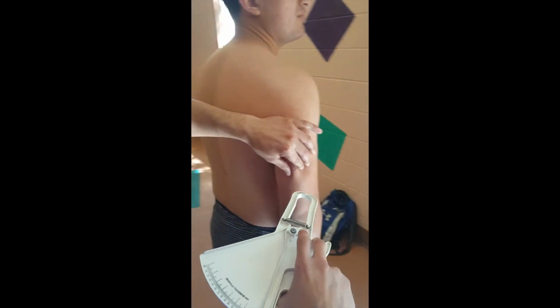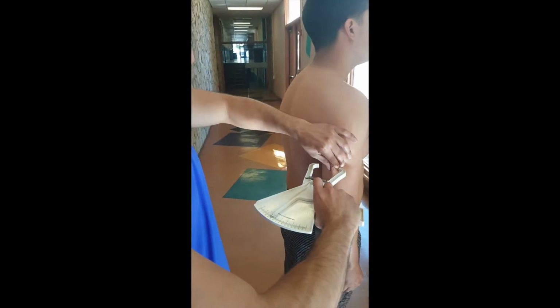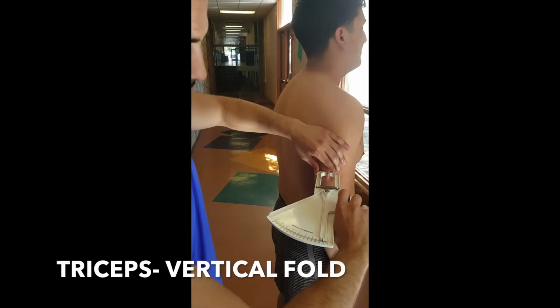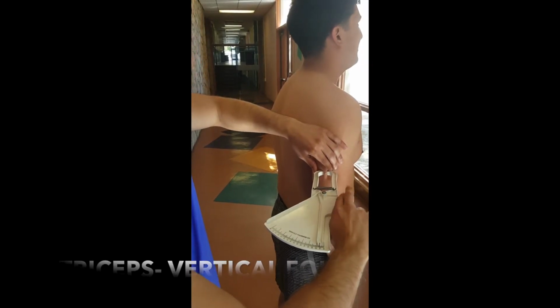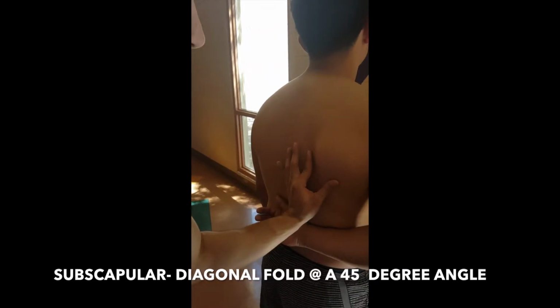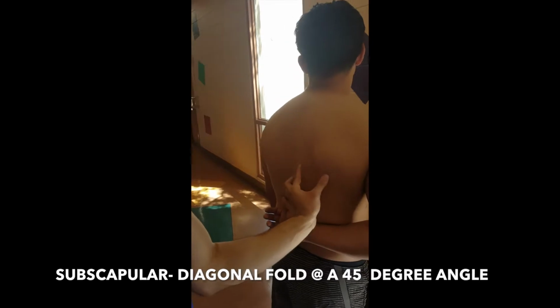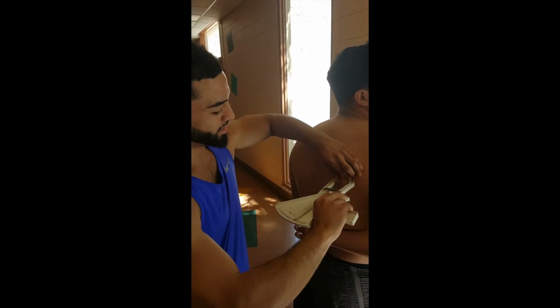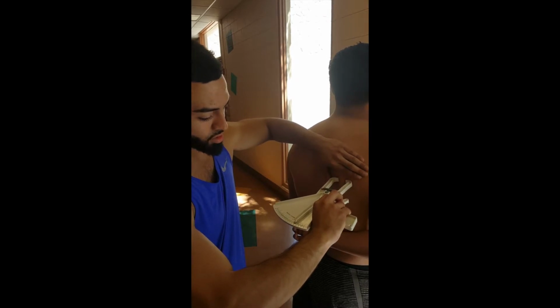With your left thumb and index finger, you will be grabbing the skin fold 3 inches apart on a line that is perpendicular to the long axis of the marked site. The caliper in your right hand with the dial facing up. Place the jaws perpendicular to the fold 1 centimeter below the fingers, halfway between the crest and the base of the fold. Record the skin fold measurement to the nearest 0.5 millimeters 1 to 2 seconds after releasing the scissor grip. Be sure to release slowly as to not pinch your subject.